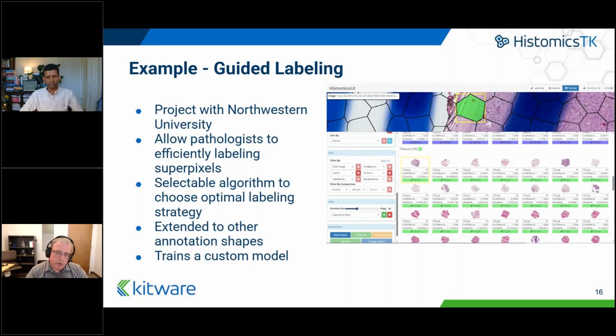And then the page I'm showing here is a review. So you can say this is what was done, and what we're looking at is, what category was this binned into. If you had a junior pathologist do this, you could have a senior pathologist review it. And so this is, again, based on our same API, but a very different front surface.